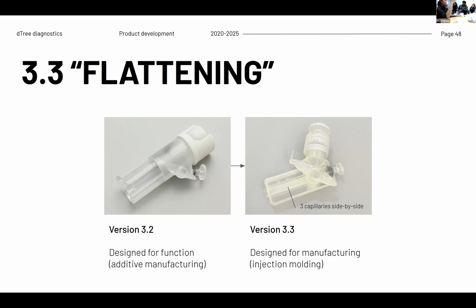The reason why we are moving away from that model is that we realized the capillary will essentially only be sealed if it fits that circular geometry, right? If for some reason you're in this curved part and your capillary is up to here, now that's not sealed. That has the potential to jump across the two capillaries. So we realized that doesn't work.